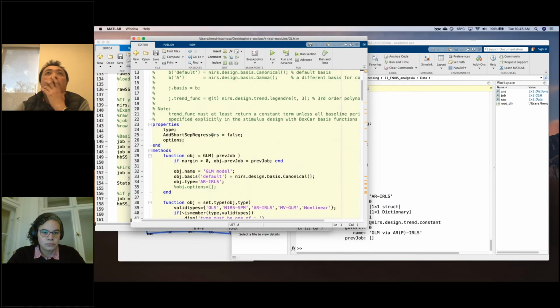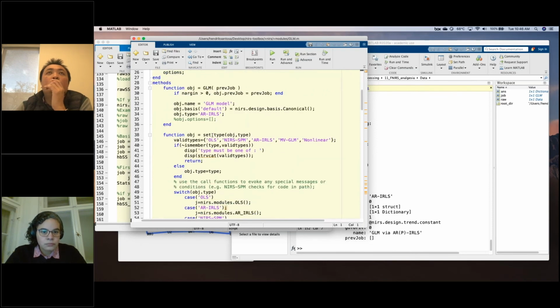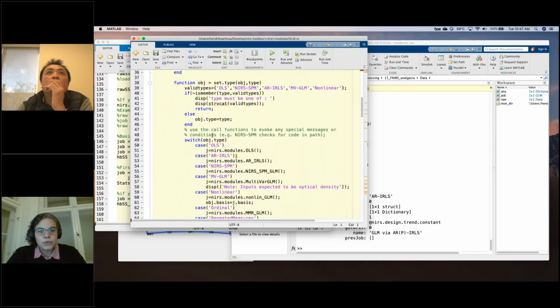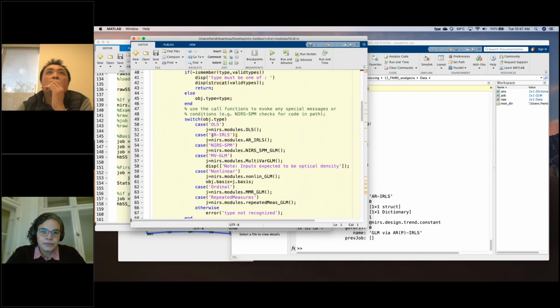Okay, so if you put that one as true, true means that it will use this combination of HBO, HBR.